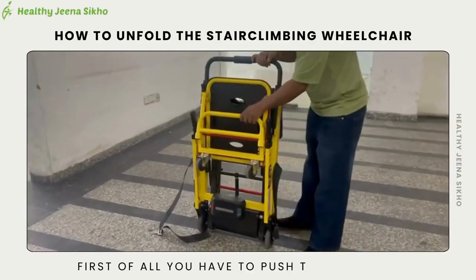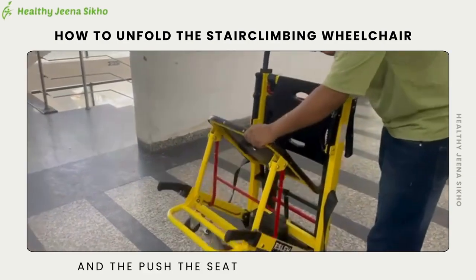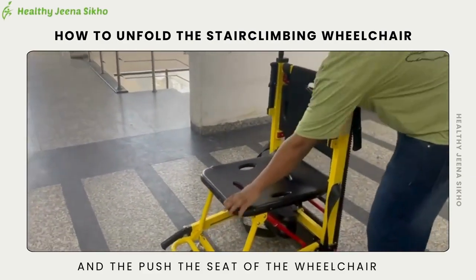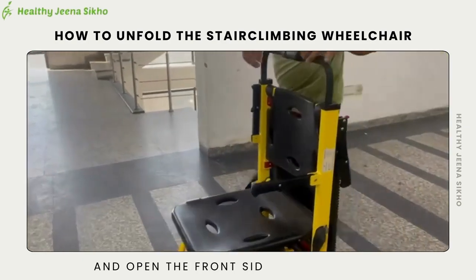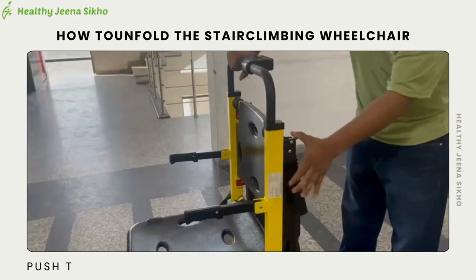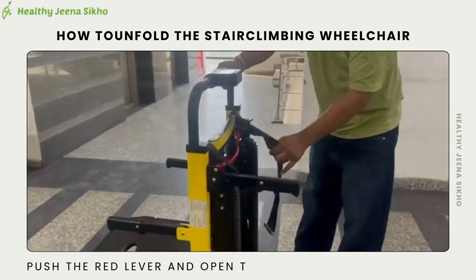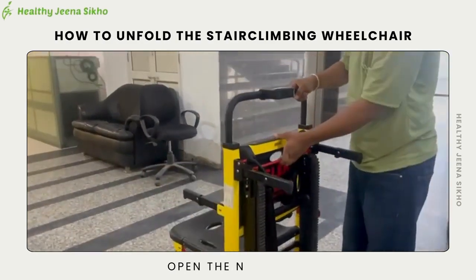First, push the footrest and then push the seat of the wheelchair. Then open the front side handle, push the red lever, and open both back side handles.